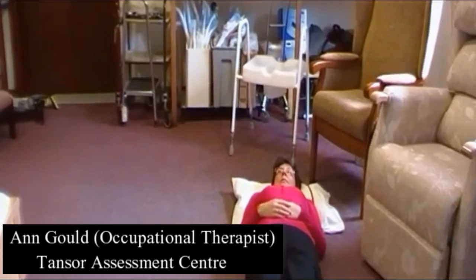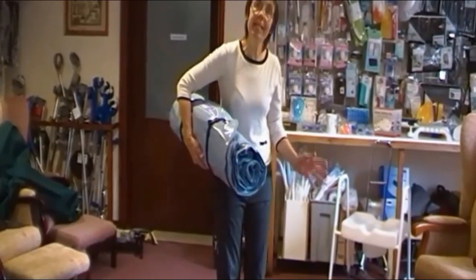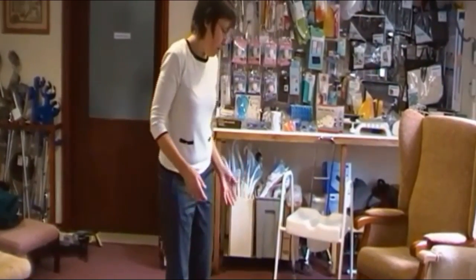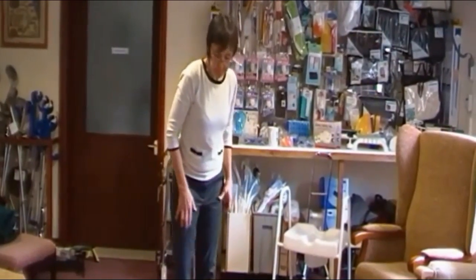Right, here we have the camel, which is a progression on the elk because it will enable someone to be sat up as well. It's particularly useful for those with dementia or for the larger person that it's quite difficult to support from behind, because the machine will do this for you.